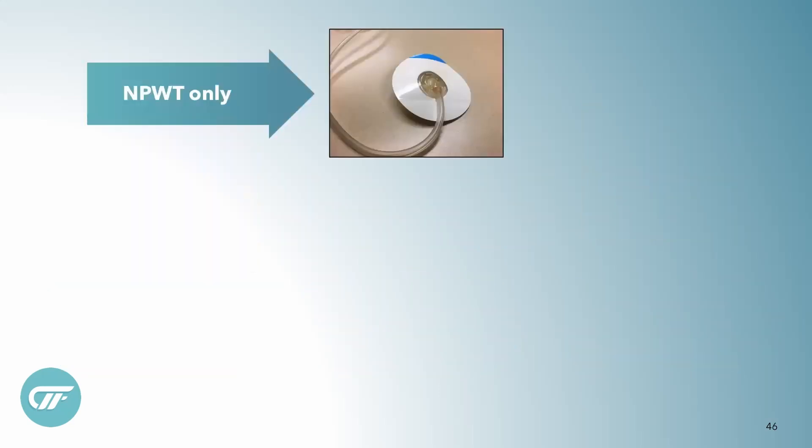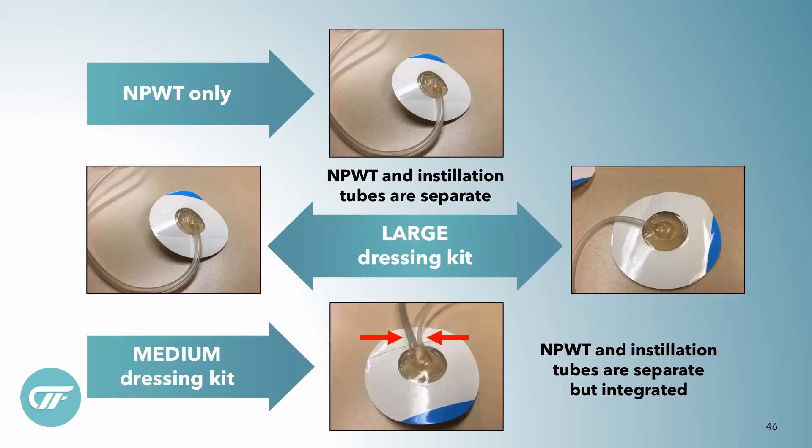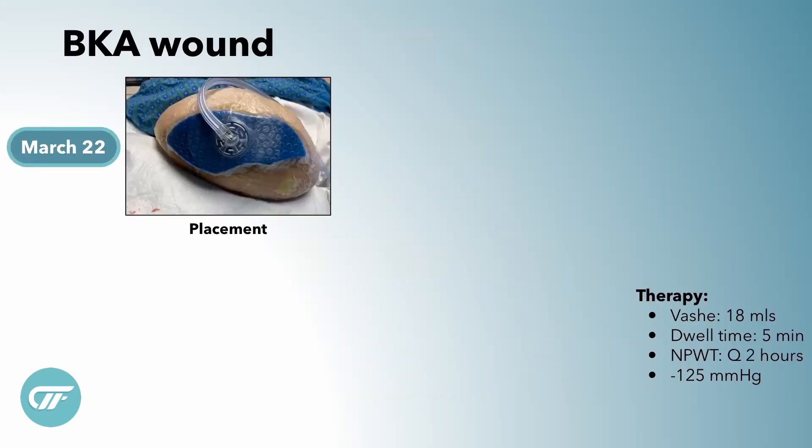Update on trackpads: we all know the standard negative pressure trackpad. In the large instillation kit, there is an independent negative pressure trackpad and instillation trackpad. With the medium kits, it's all combined together. This is an example of a below-the-knee amputation wound, and we're using a medium kit with the combined instillation negative pressure trackpad.